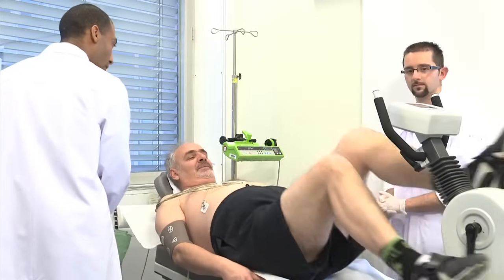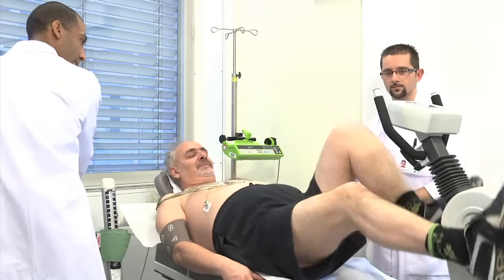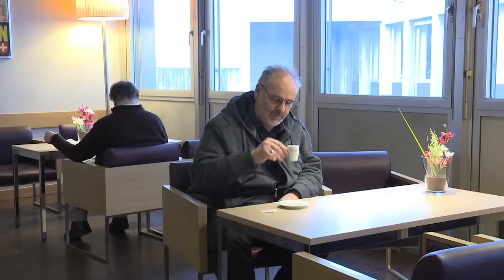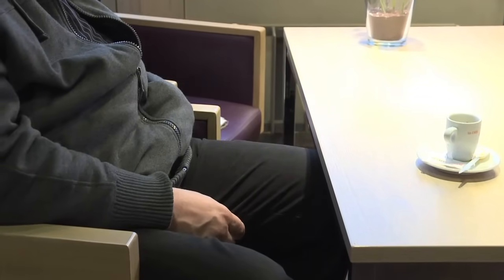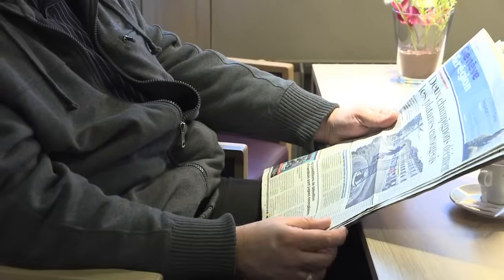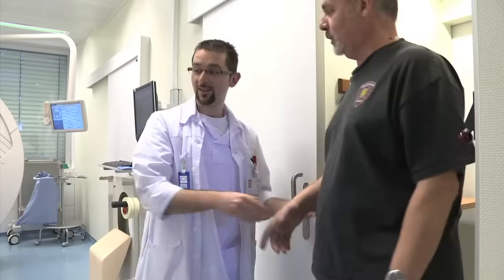Vous pouvez pédaler plus lentement. On va pouvoir arrêter le test d'effort. Après l'injection, un délai d'attente de 30 minutes est nécessaire pour que le produit se fixe correctement. Pendant cette période, le patient peut disposer librement de son temps. Il est maintenant possible de boire du café, du thé ou du chocolat. En accord avec le médecin, les traitements interrompus avant l'examen peuvent être repris.